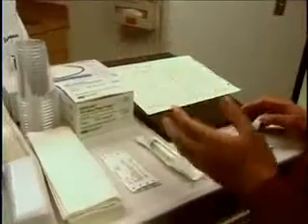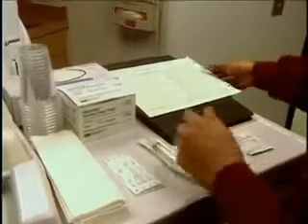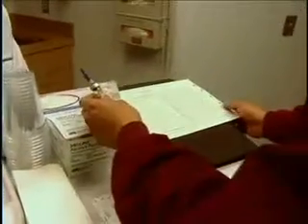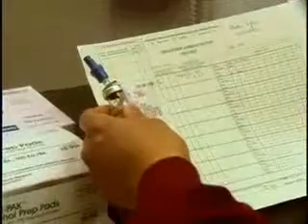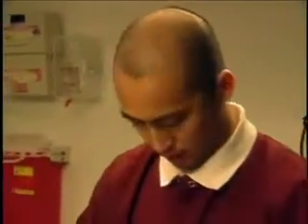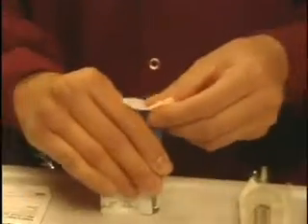I also calculated the drip rate for the prescribed infusion time, in this case, 40 drops per minute. Now, I used the MAR to identify the correct medication. And I compare the medication label with the MAR. I see. Look at you. Next? Well, next, I'm going to withdraw the medication into the syringe. First, let me wipe the tip here.